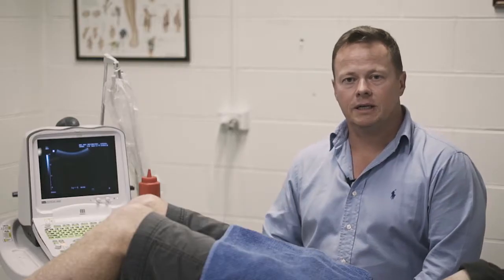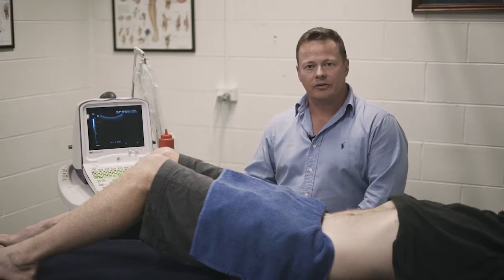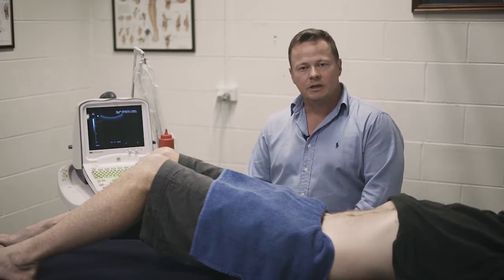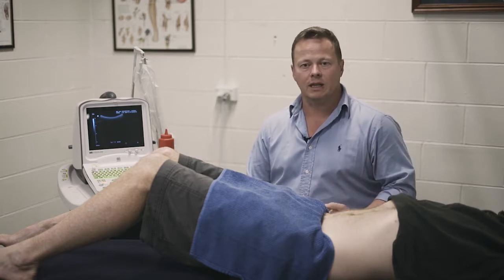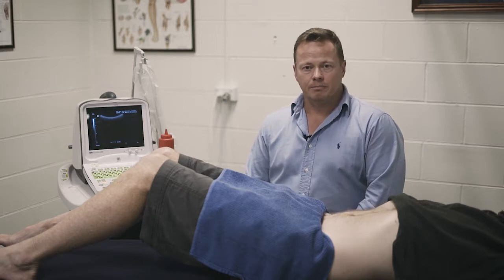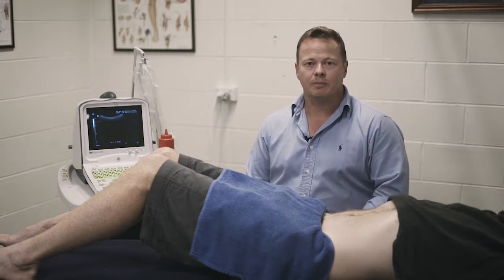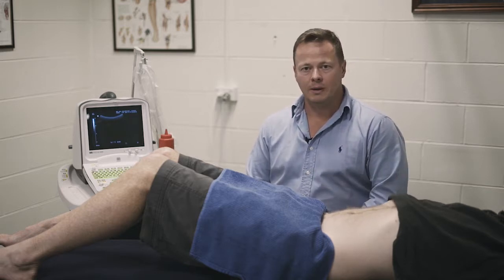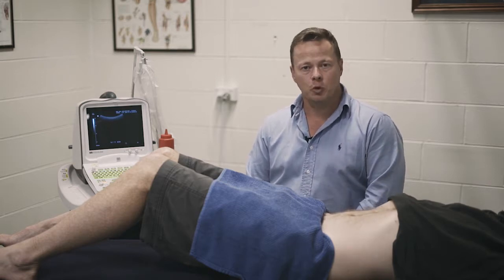Another useful tool we use in the clinic is ultrasound biofeedback. It helps us as clinicians see what the patient is actually doing with their abdominal muscles and lower back muscles in activating for core stability. This tool is quite useful in allowing us to teach patients how to pre-activate their core stabilizers before they actually create force.